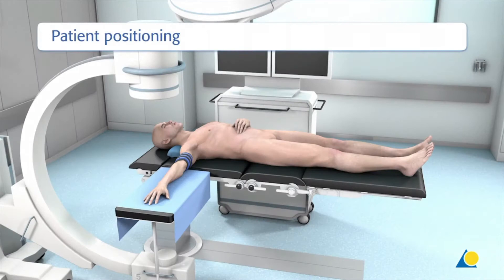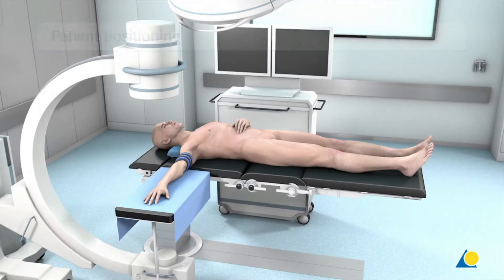The patient is positioned supine on the operating table with the arm placed on an arm table at the level of the shoulder joint. The use of a tourniquet is strongly recommended. A fluoroscope is positioned opposite the surgeon to allow intraoperative radiological examination.